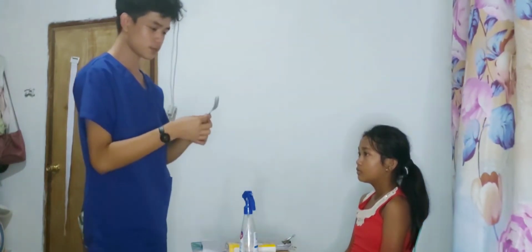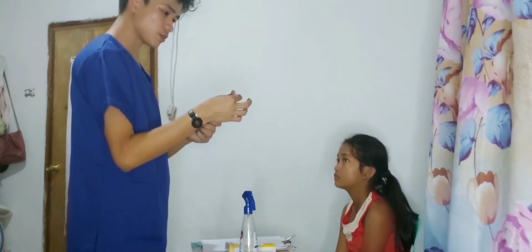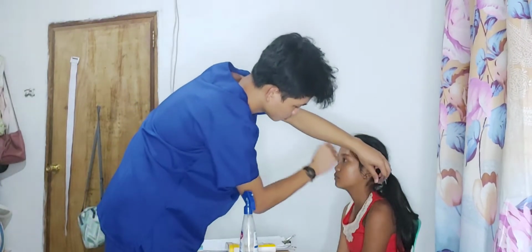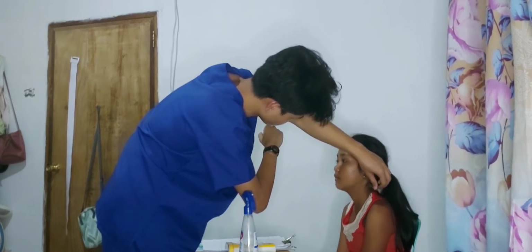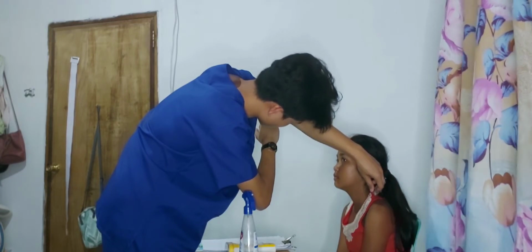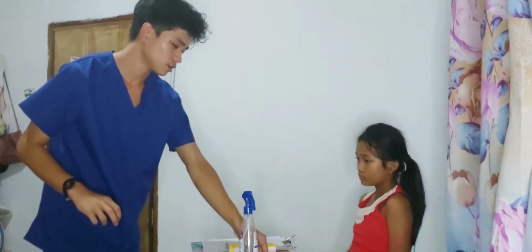So, ma'am, I'm going to vibrate this. I'm going to put it in your mastoid. Narinig ka ba po? Opo. Narinig ka ba po? Wala. Wala po. Okay.